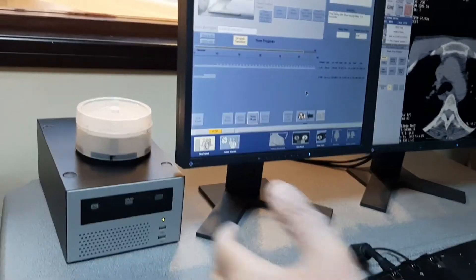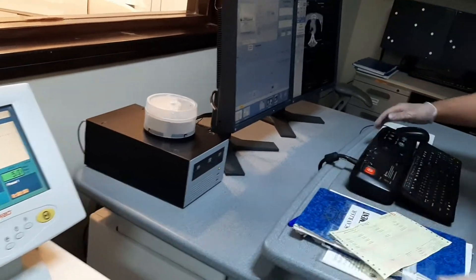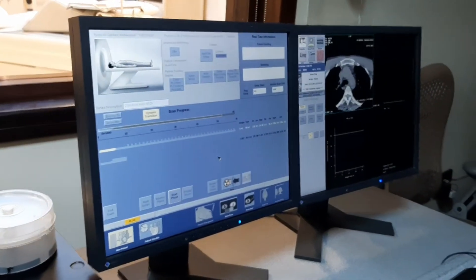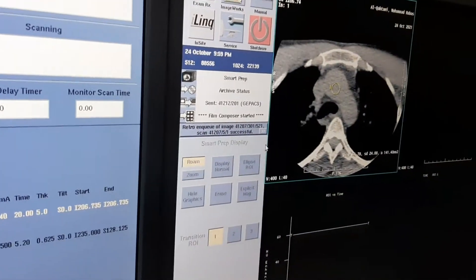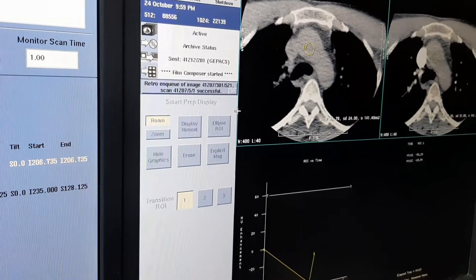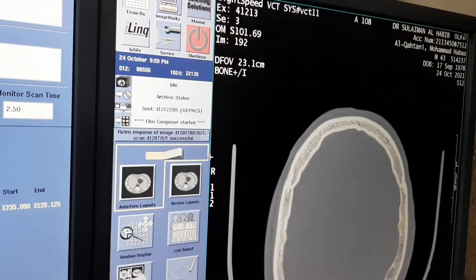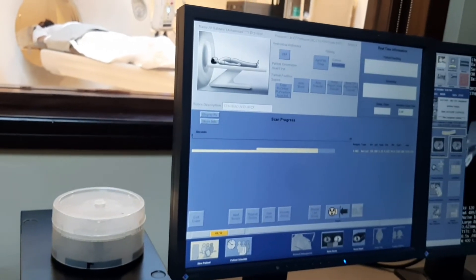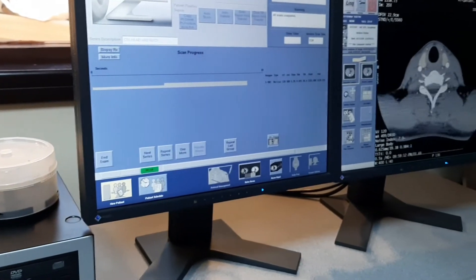Yes, now again go together — don't miss. This one will automatically scan when there's already enhancement there. When there's enhancement, it will automatically scan. Scanning, scanning, scanning — and it will include all the tail. Different — so this is good timing.